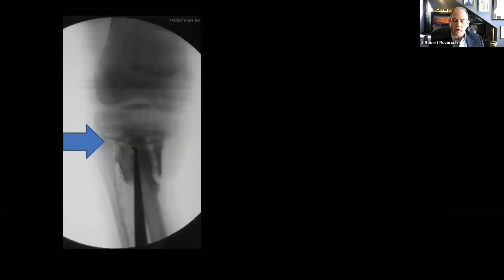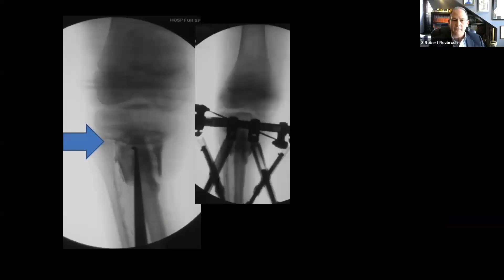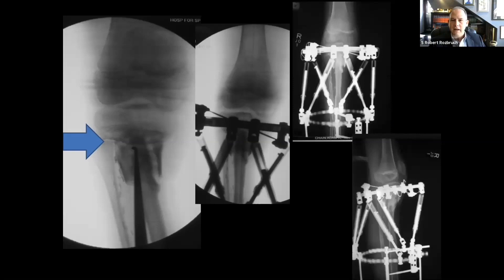My approach was a minimal incision technique, given the flap, to stimulate non-union repair of the proximal tibia and to inject bone graft. I used the fixator to correct the deformity and provide compression and stability. This is what it looks like after the fixator had been on for some time and union was achieved.